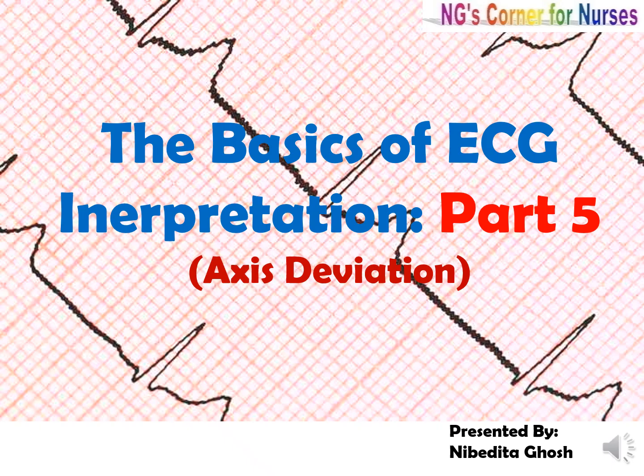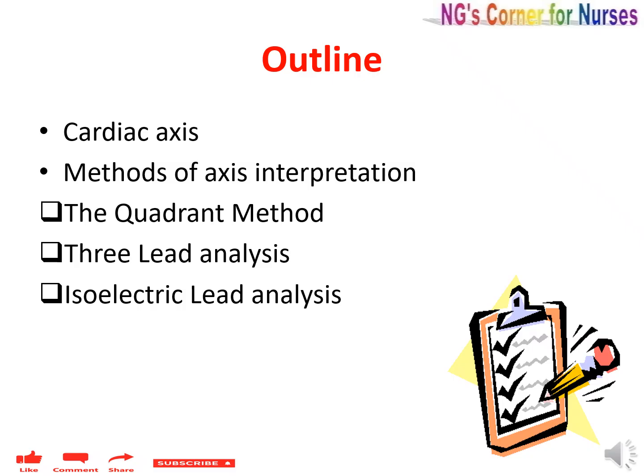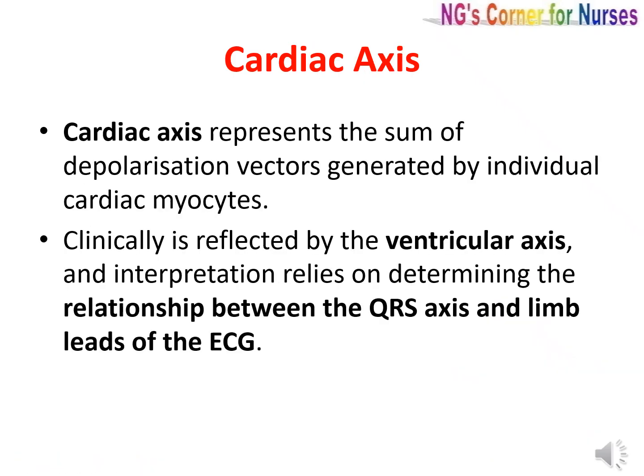Today we are here with the last part of the basics of ECG interpretation. In this video, we will cover the axis deviation. In this session, we will know what is cardiac axis and the methods of axis interpretation. Let's know what is cardiac axis.